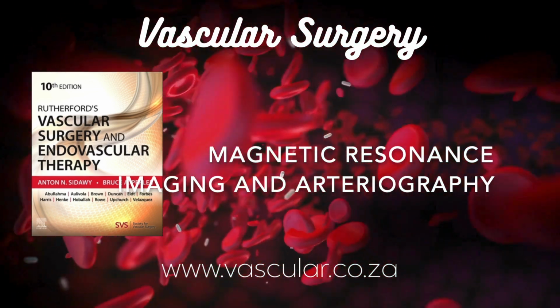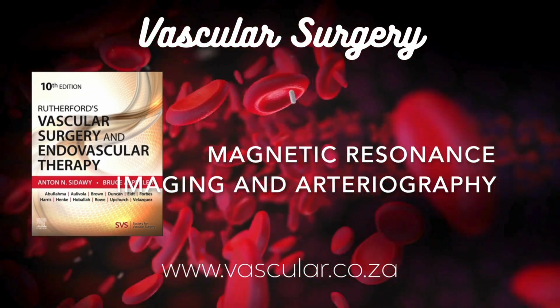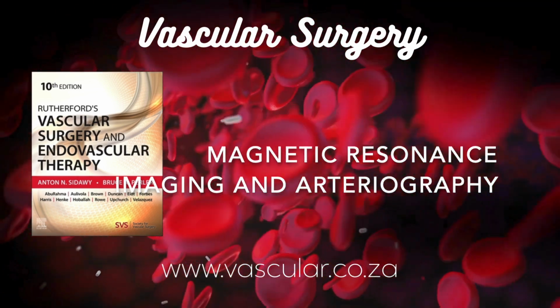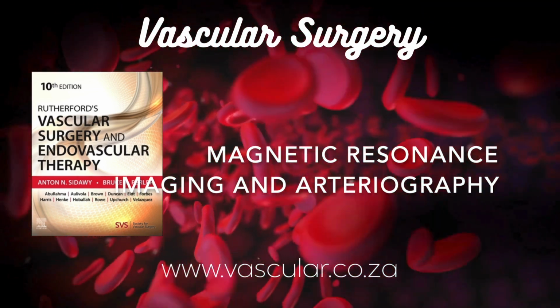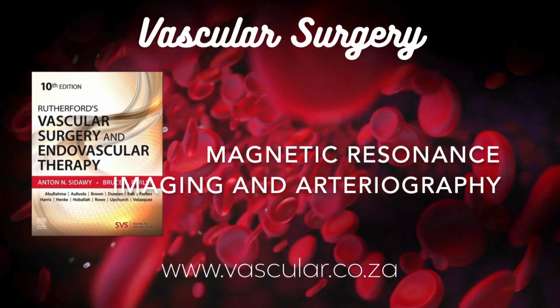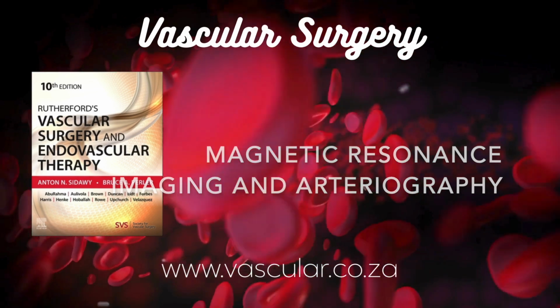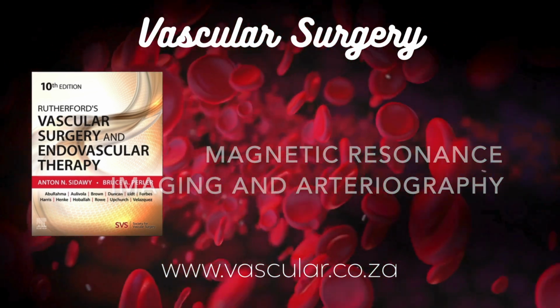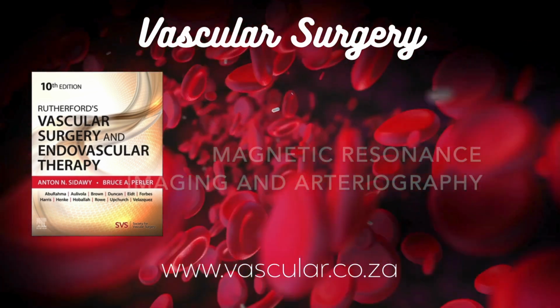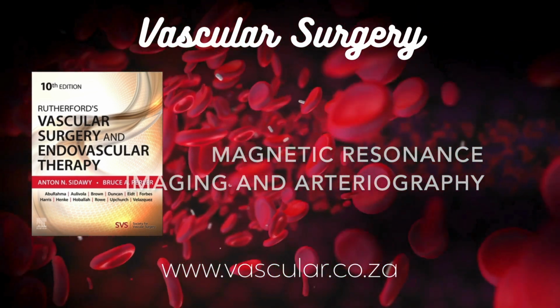Historically, non-contrast MRA techniques like time of flight, or TOF, were maybe seen as a bit less reliable than contrast-enhanced MRA, which usually gave, well, arguably better images. But something changed. Yes. The discovery of a link between gadolinium-based contrast agents, GBCAs, and a serious condition called nephrogenic systemic fibrosis, or NSF, particularly in patients with poor kidney function. That discovery led to a major resurgence of interest in non-contrast techniques. It's a way to potentially avoid that risk altogether in vulnerable patients. These methods let us see blood flow without any injection, which is a huge deal for people with kidney problems.